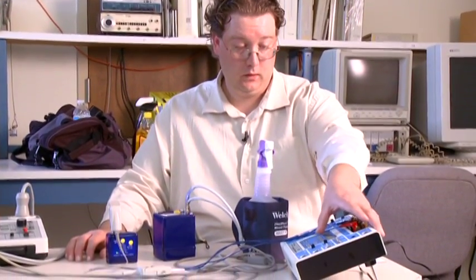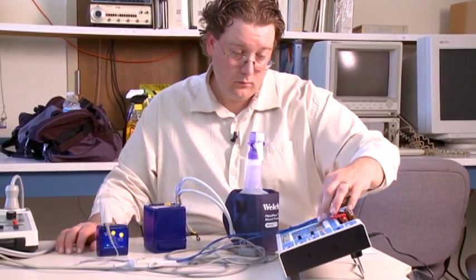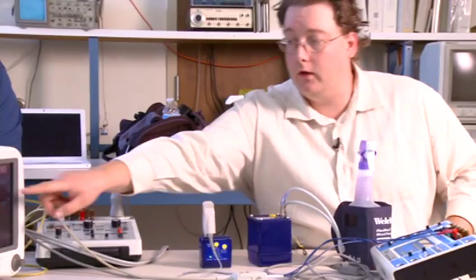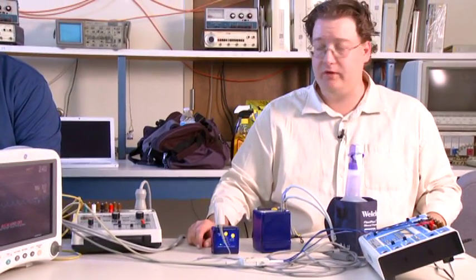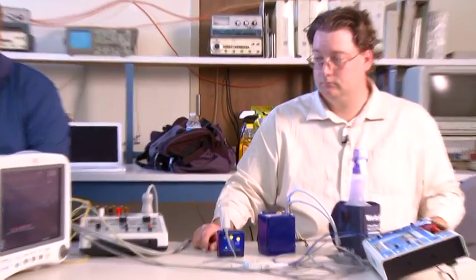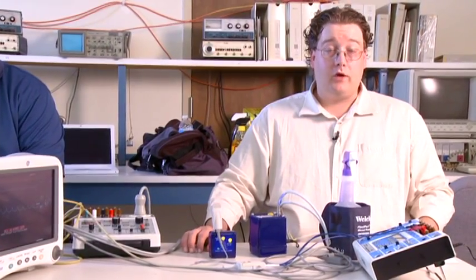The final respiration test we're going to do is for apnea. Apnea is no breathing. We'll be doing an apnea test, which indicates a patient not breathing. We're going to set this to apnea, and continuous. And we should stop seeing detection of the breath and start seeing a straight line across here on the monitor. And the respiration rate will be dropping, and we should get an apnea alarm when it gets down below 10 or so. Just a couple moments from now, it should detect and throw up an alarm. And apnea. We got the alarm. Joby, if you could check that alarm box. And that concludes the respiration portion of the PM test.